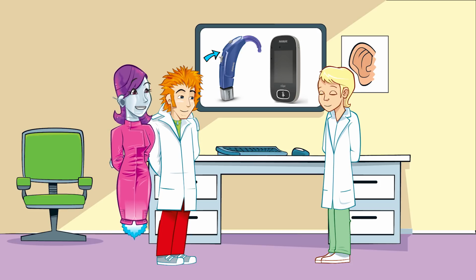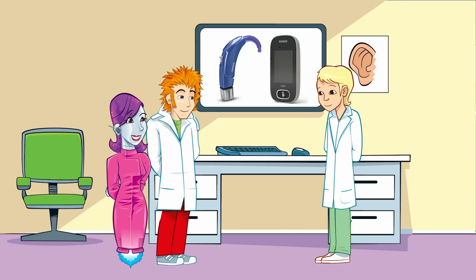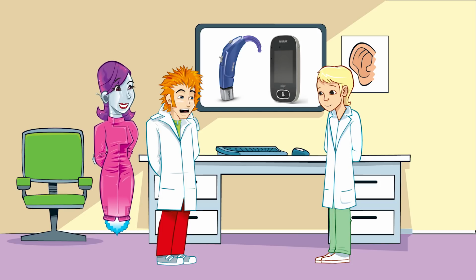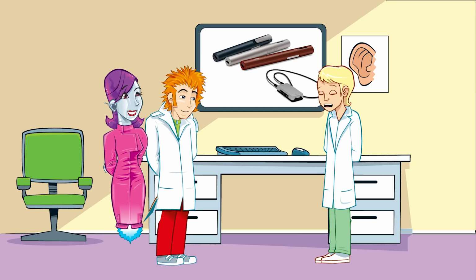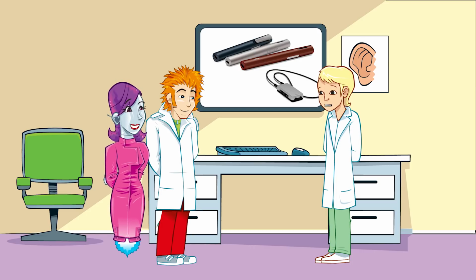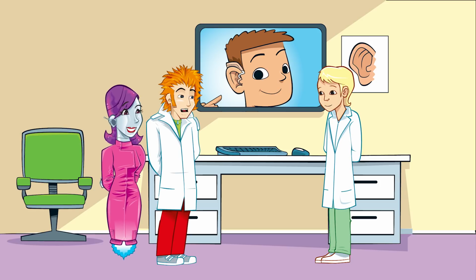Well, that sounds like a great idea for school, or if you're playing sport. You'd be able to hear the coach shouting at you. Sarah, keep your eyes on the ball. Or your mum cheering you on. And it looks like they come in lots of different shapes and sizes. Yep, there are pen microphones, microphones that you can wear on your shirt, ones that you can place on a table, all sorts. Roger that. It's terrific to know that all levels of hearing loss can be helped by modern technology.